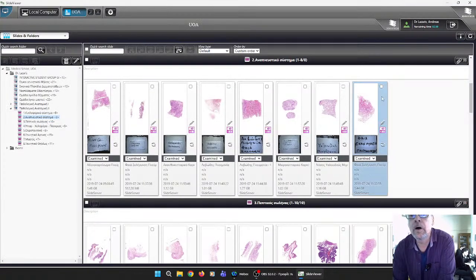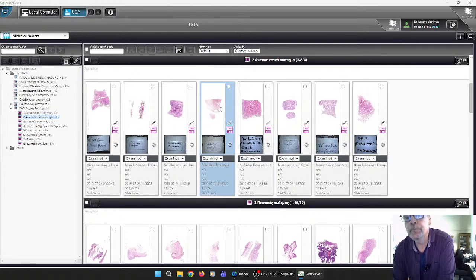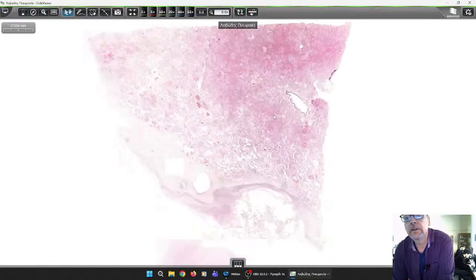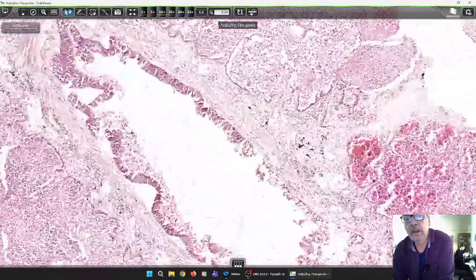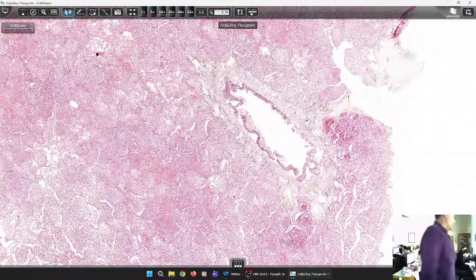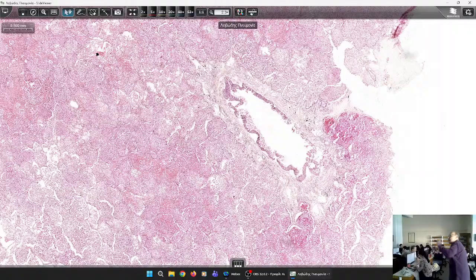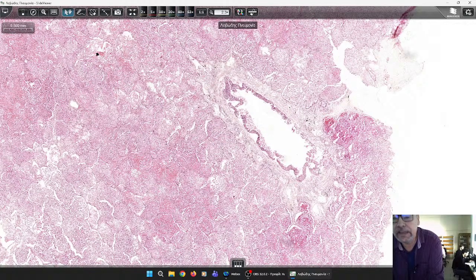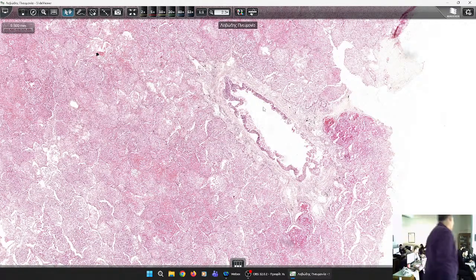The first case we are going to examine will be, pay attention, this one: lobar pneumonia. So, open the slide, please. And we'll try to identify this structure. This structure. What does it look like? What histologic structure is this within the lung parenchyma?